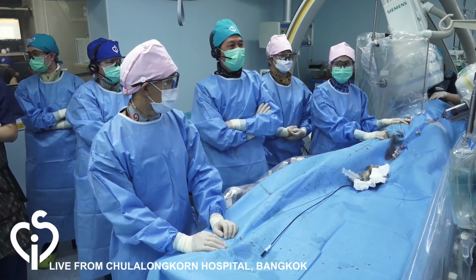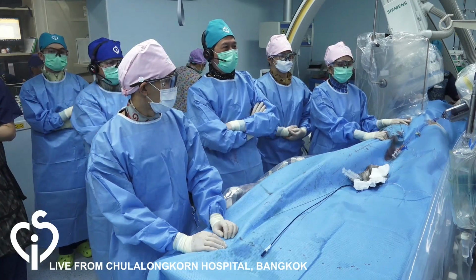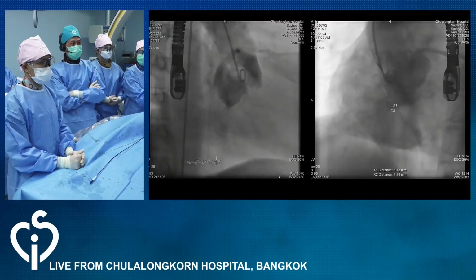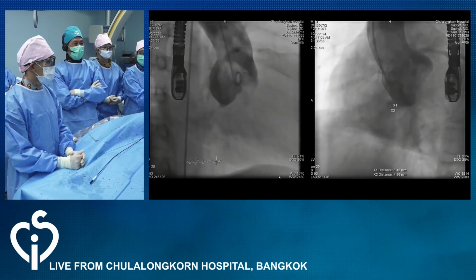Good case. So I will show you the angio. Perhaps you have one more question or comment here. LV dysfunction can be explained with acute rupture. That itself can cause volume overload and generally PAH and LV dysfunction.